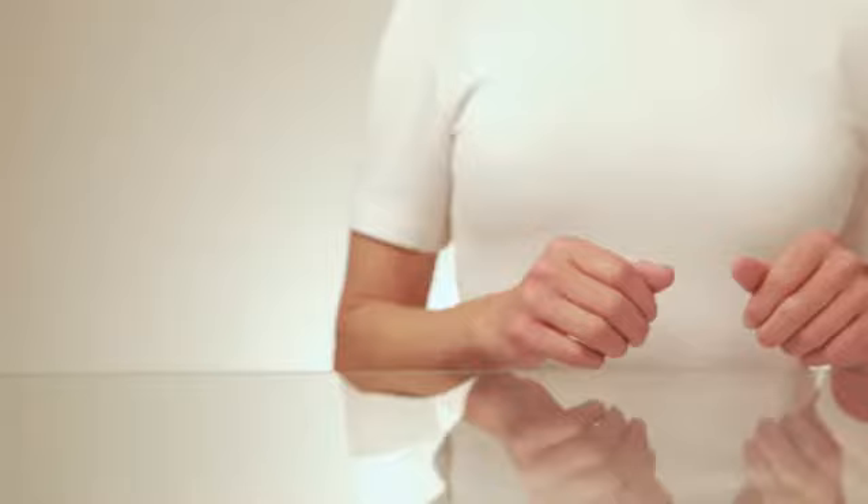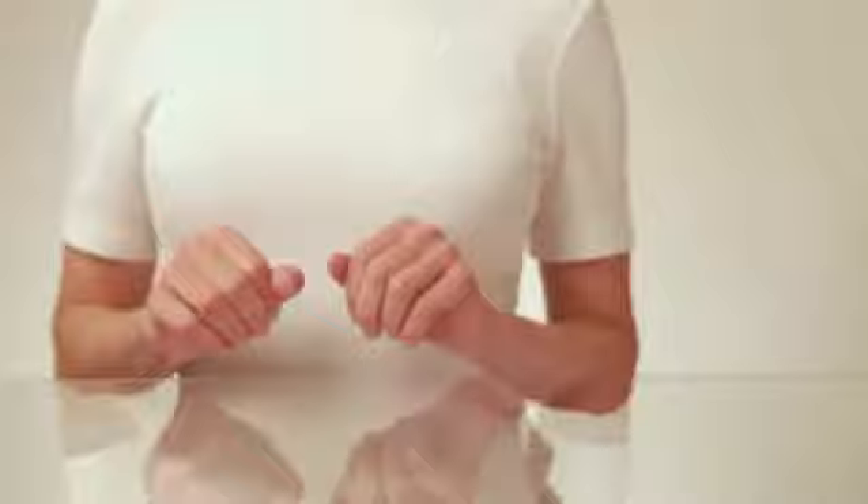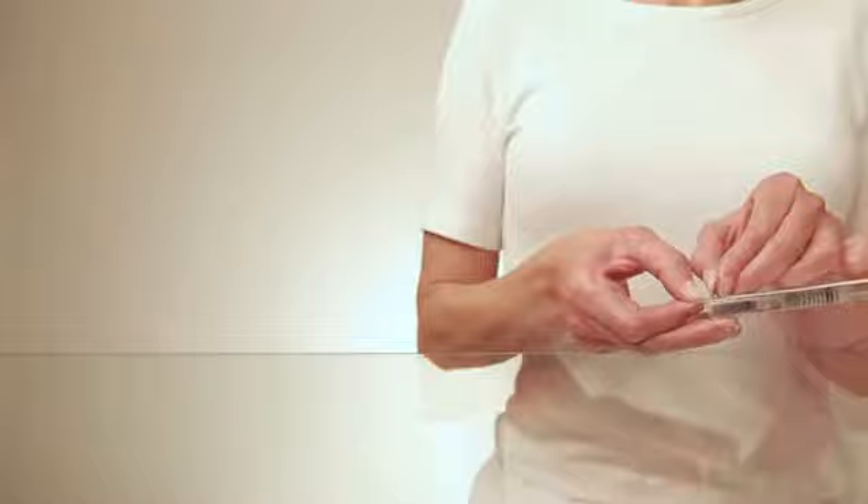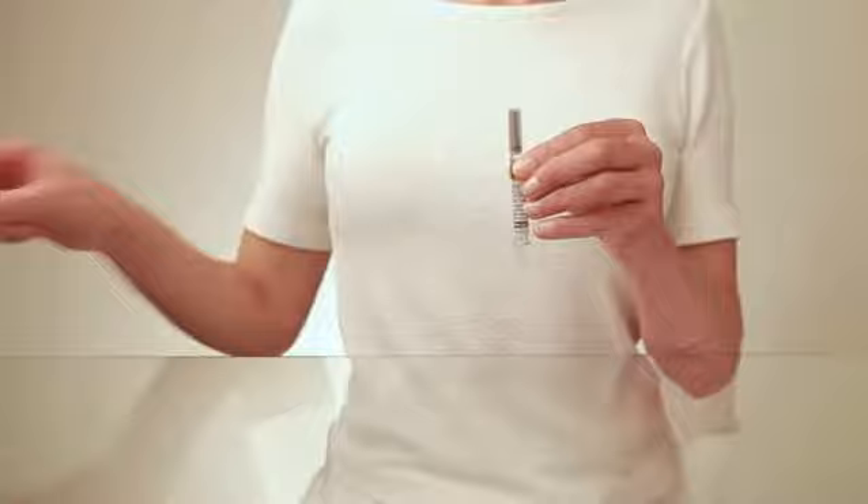After you have washed your hands, you can start your injection. Open the box and take out the syringe. Open the packaging by pulling off the plastic at the back. Take the syringe out of the blister pack.